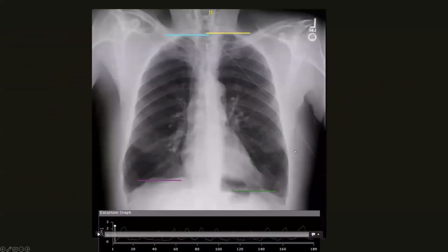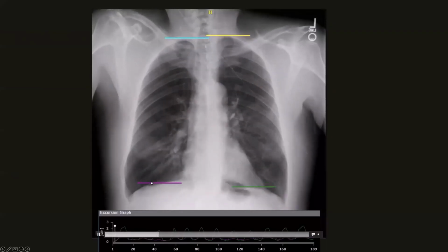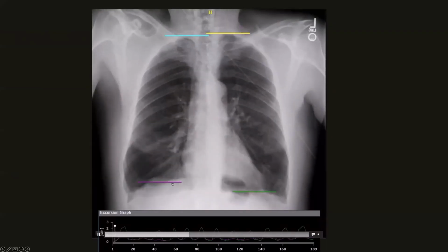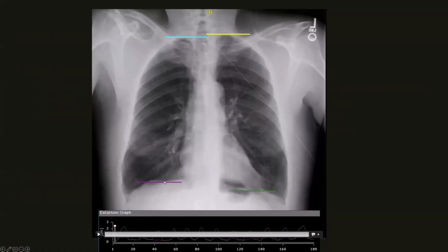This first example is a patient that came in for a pre-lung transplant workup. It's a patient with COPD. So you can see the esophageal pH monitor in place. But he got this DDR. And if you look at the images here, you can see that there's flattening of the diaphragm with somewhat limited excursion bilaterally. But if you compare the left to the right hemidiaphragm motion, you can see that the right hemidiaphragm is not moving quite as well as the left hemidiaphragm.